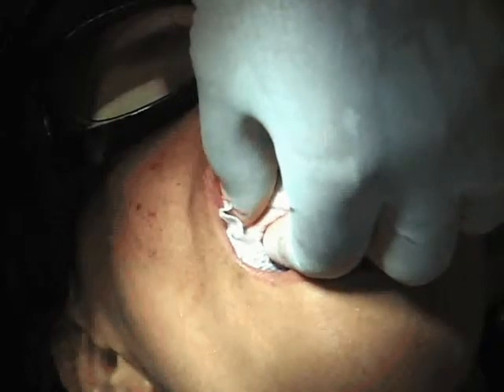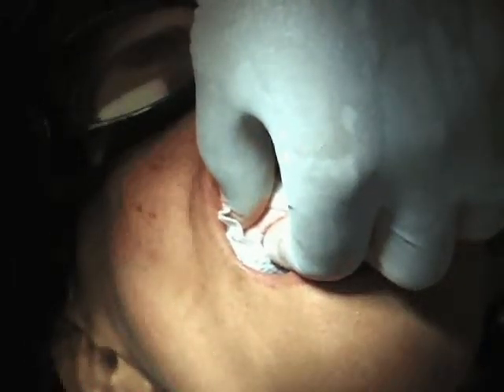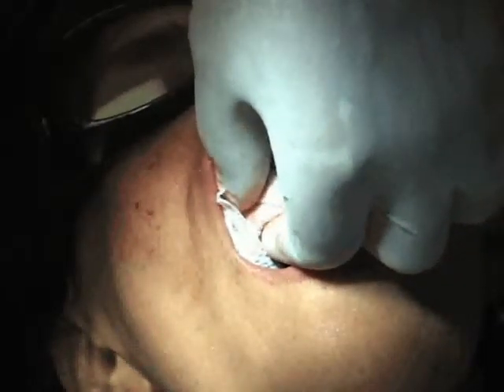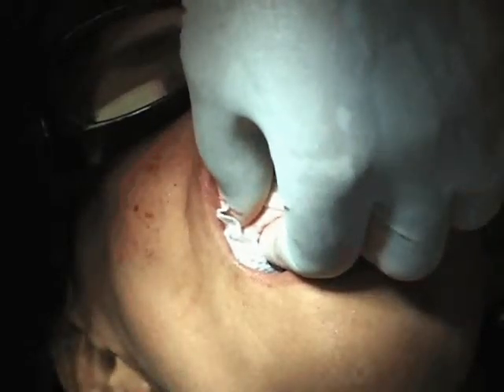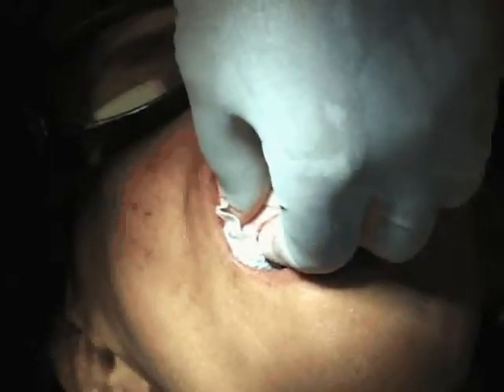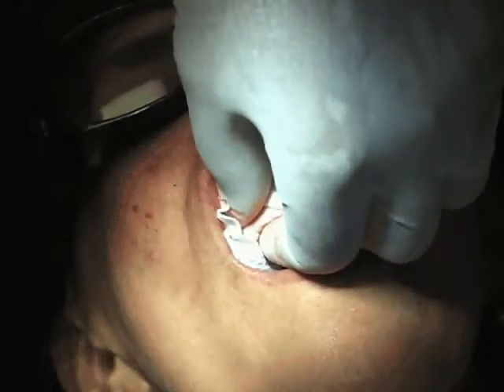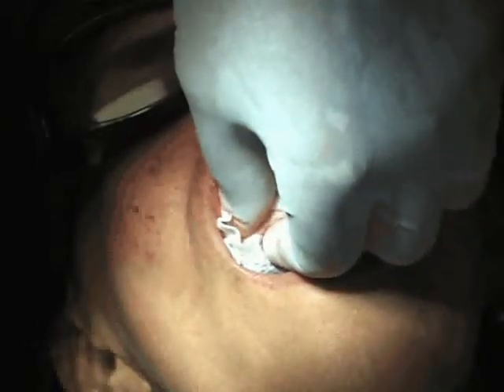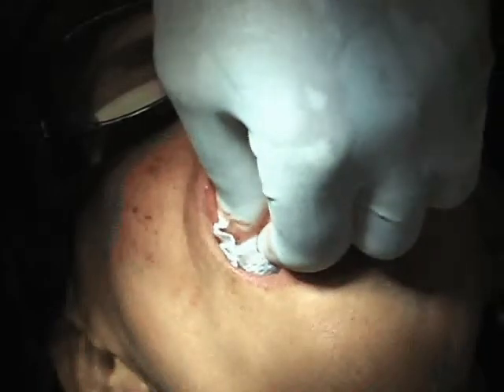On tooth number six, we decontaminated that, etched it, and then treated it with fluoride. We might get some bone attachment, periodontal ligament, or regeneration of that structure. The key here is the fluoridated HA will prevent infection from getting into this area, which basically saves the implant without having to remove it. And that's about all we can expect in this situation.